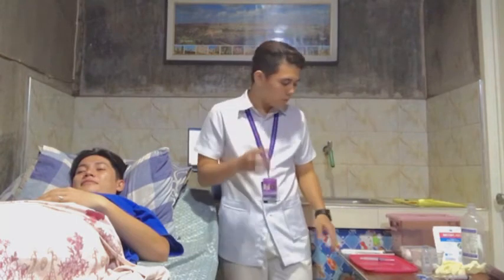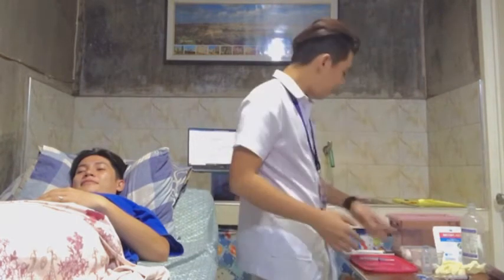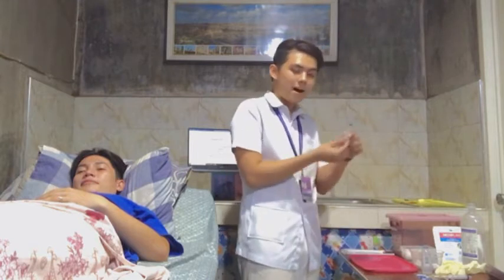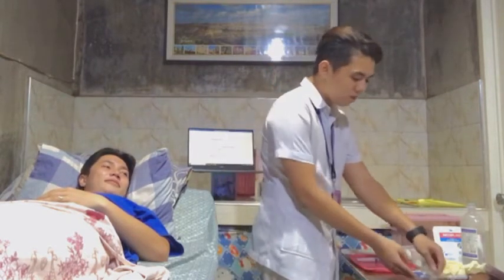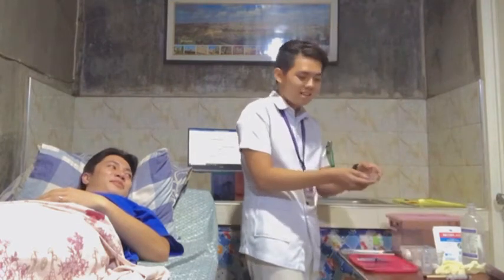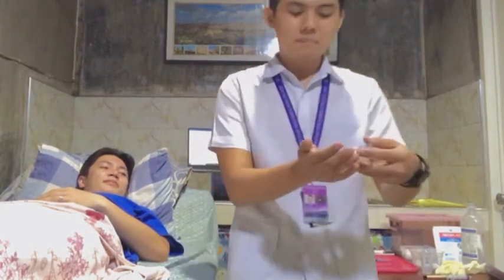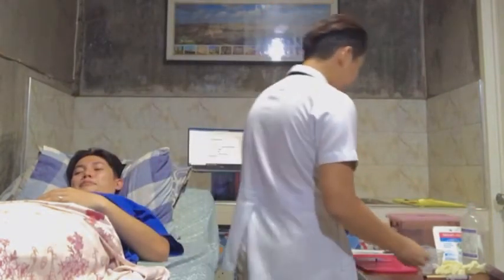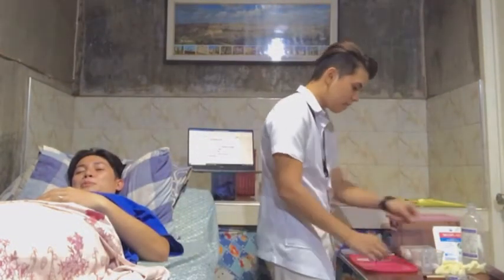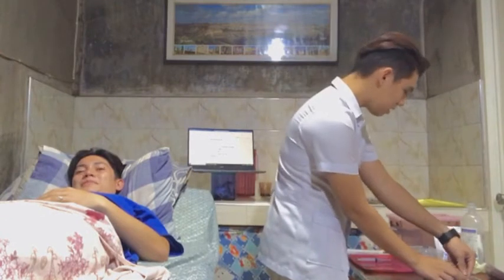So of course, we need to withdraw the medication. So this is the 5 ml syringe for intramuscular. We will be withdrawing the medication from the ampule. So this is a sample of a sodium chloride ampule. So let us start.